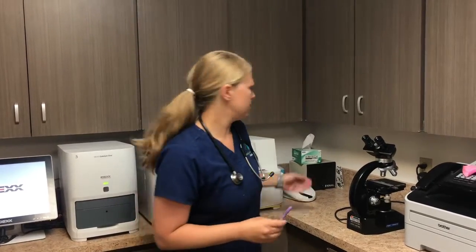For this video, I will be demonstrating how to perform the activated clotting time test to tell if the patient's able to actively clot their blood. I've got tubes incubating at 37 degrees Celsius for about 20 minutes now, and I'm going to collect blood directly with the vacutainer into the tubes without any anticoagulant.